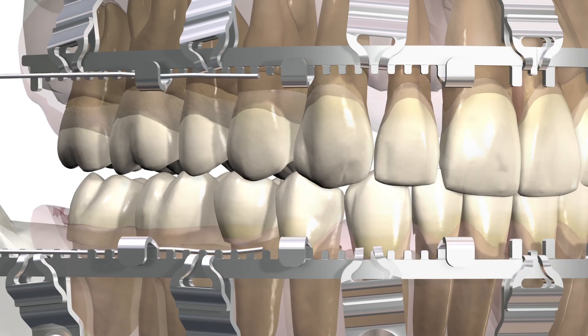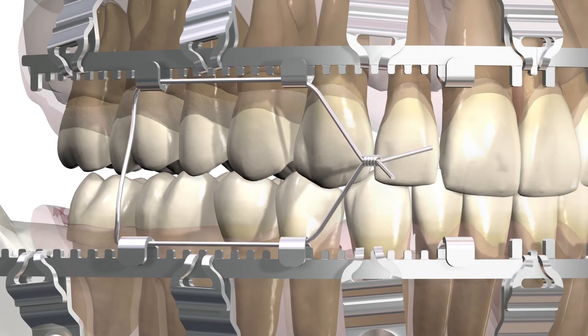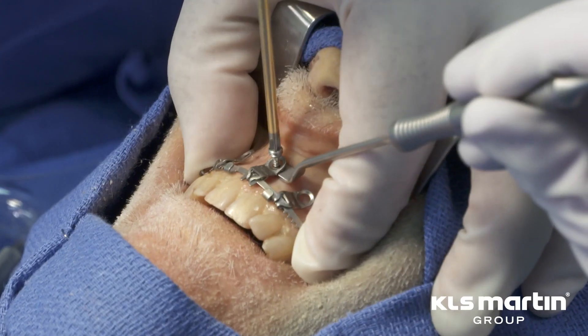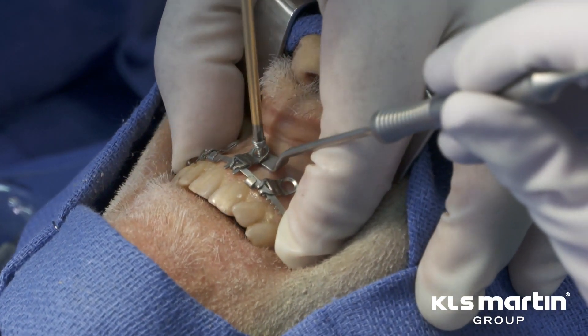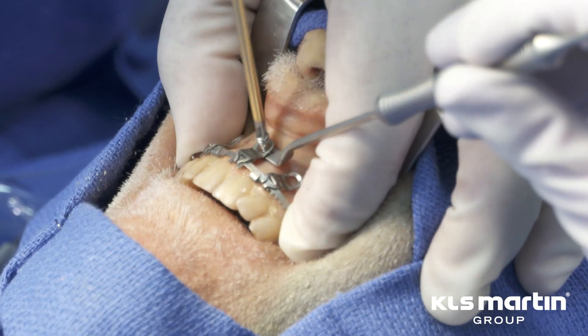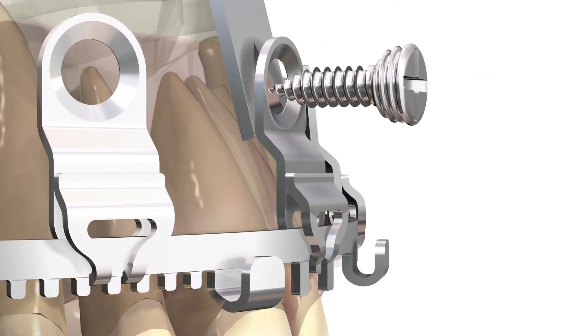The slider plates engage the tooth edge of the L1 MMF arch bar when tension is applied to the wires as they engage traditional wire hooks. Compression of the gingiva, the second most important consideration, is prevented through the automatic lifting of the plate off of the soft tissue as the reverse locking threads of the screw engage the plate during the final turns.